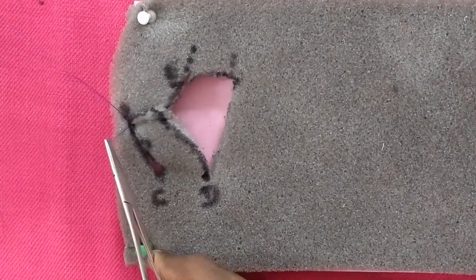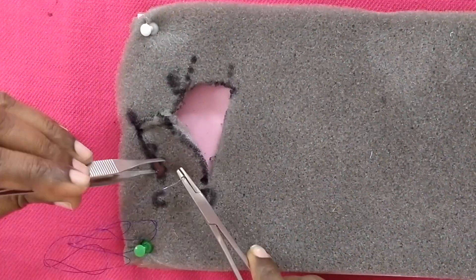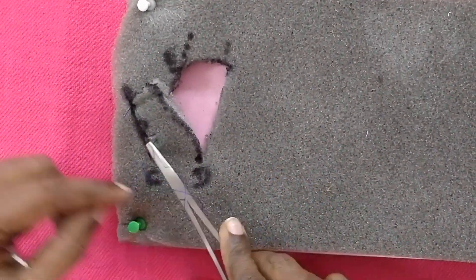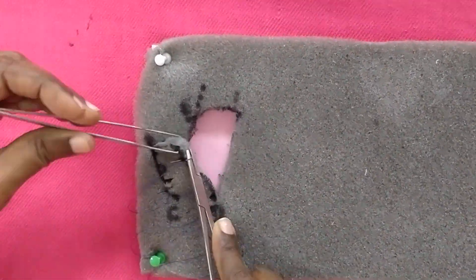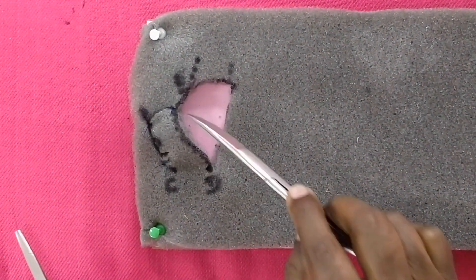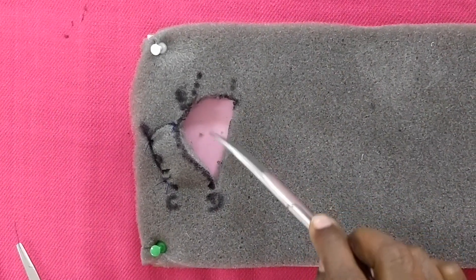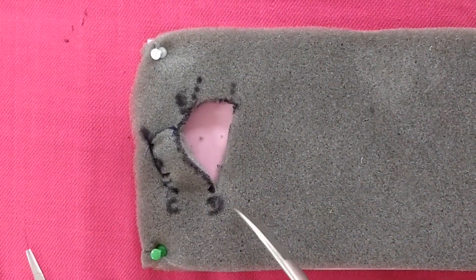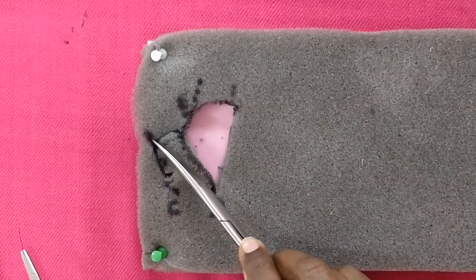The flap inset is done. Now the residual raw area which is formed after the raising of the flap, otherwise known as a secondary defect, is covered with a skin graft. I hope you liked this video.